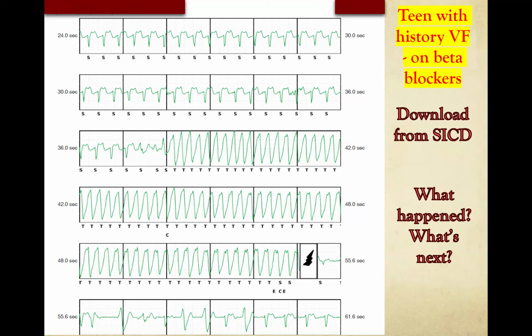But one of the reasons why in that particular case I probably would replace the device is because the patient is atrially paced. About a year after we put in the single chamber device, they complained a lot about being tired. So we placed an atrial lead in that patient, and pretty much since then the patient has felt great and is paced 85% of the time in the atrium because they're on a very high dose of beta blockade.